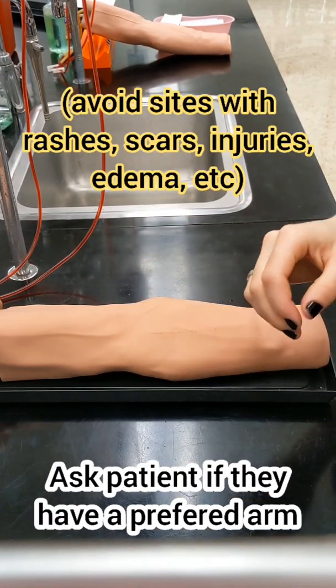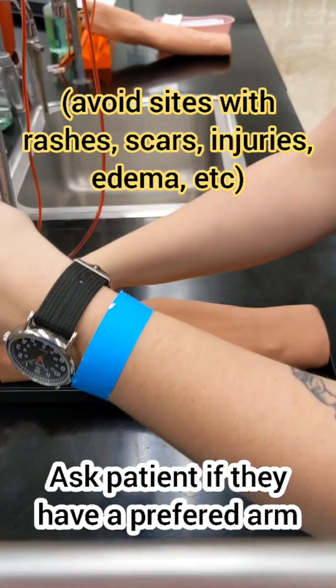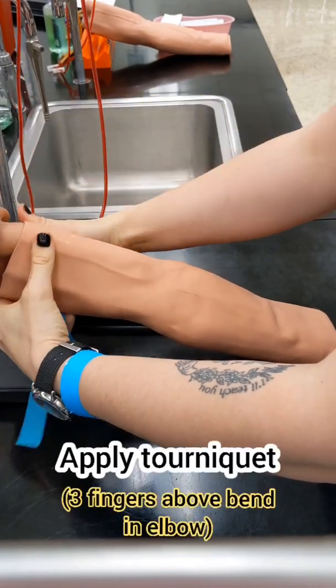Some patients are going to have a preferred arm. Just make sure you choose a site that doesn't have any rashes, scars, injuries, or edema.